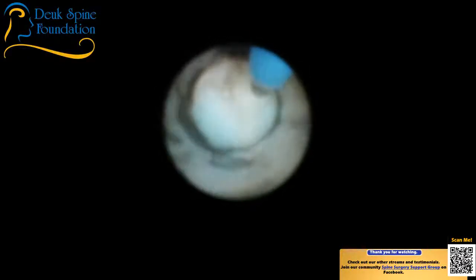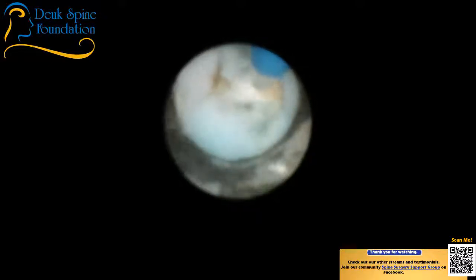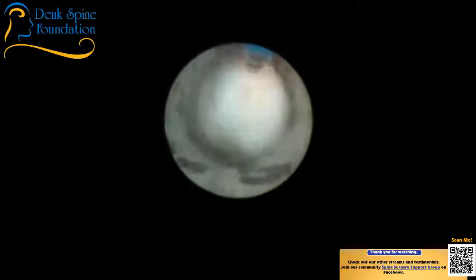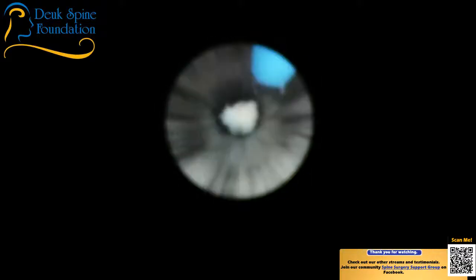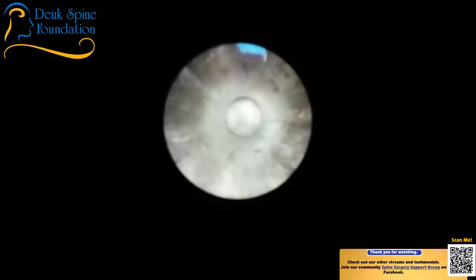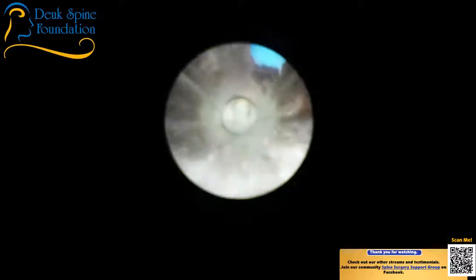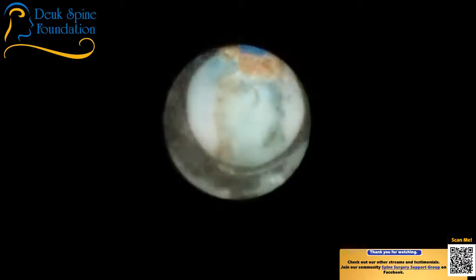I send it to them to check them. The other scope, I say, hey, dude, where's my scope? And then it said, I forget that I send it to Texas. They're very bad right now, like all the parts and everything. Oh, look at that herniation. That's another herniation right there. So the scope repairing people are in Texas? Yes. Well, that explains. In the next couple of days we have it over there. Yeah, good. And that's a lumbar or cervical? Lumbar. We have plenty of lumbar scopes.